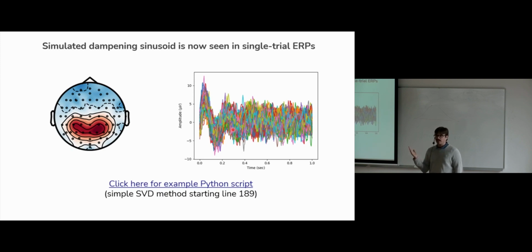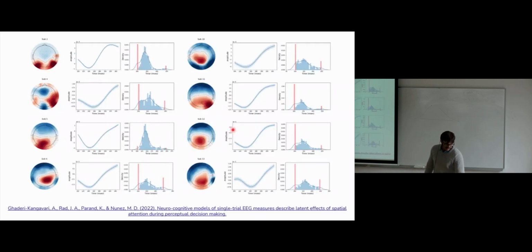There's probably things that outperform. You could also take this and do some deconvolution in time. This doesn't do any deconvolution in time, right? But this is something to get a much better signal-to-noise ratio if you have high-density EEG. Now we've kind of advanced the methods in some way.